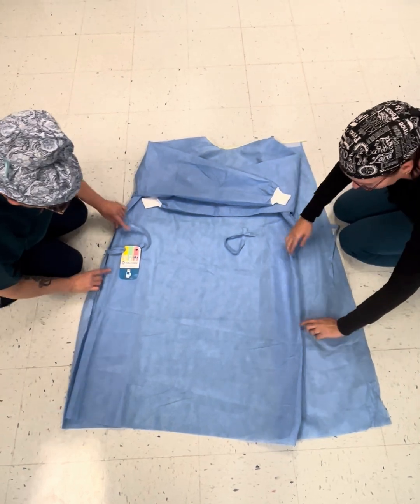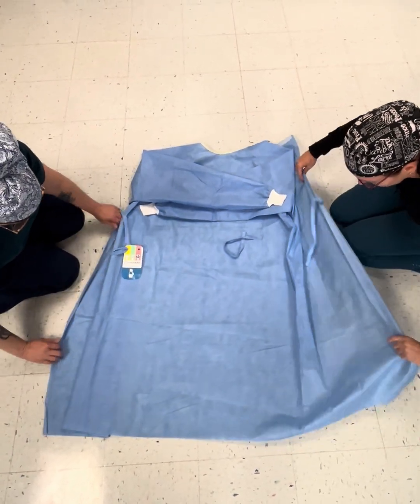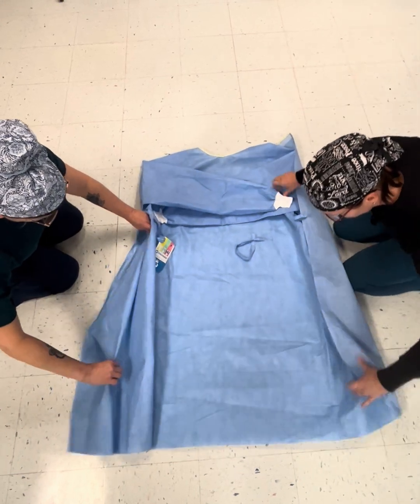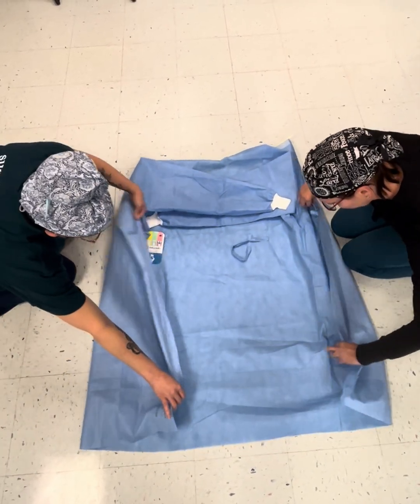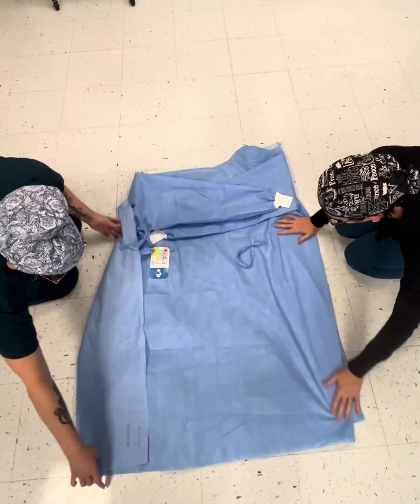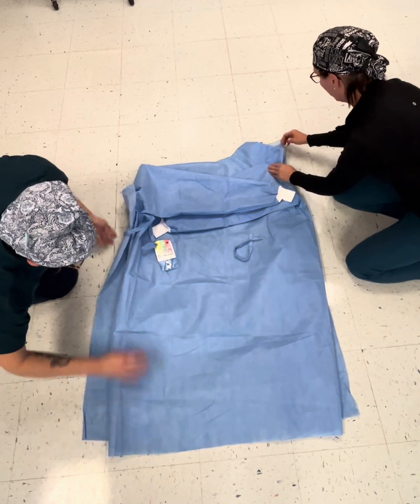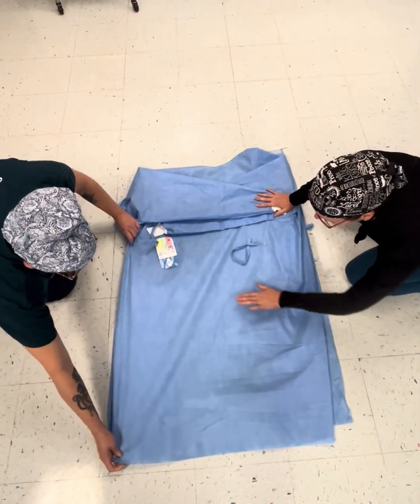Each side here, follow your crease. So this first crease brings it over and then the second one brings it back. Make sure you have a nice smooth line and that line goes all the way to the top through your velcro. Smooth it out, kind of get your air out.